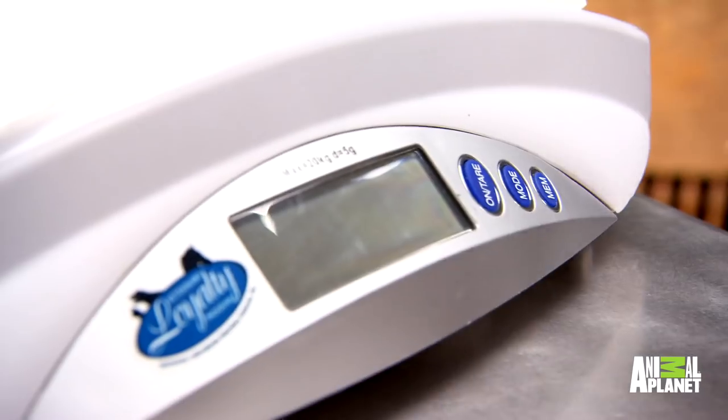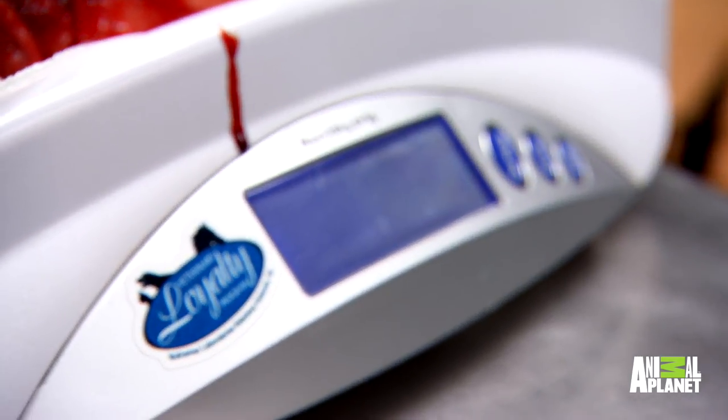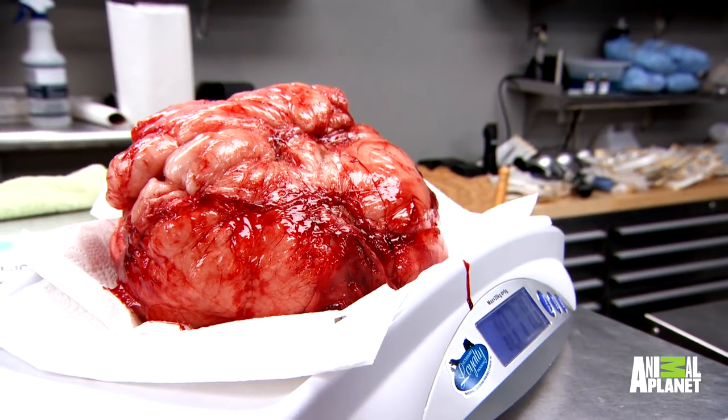How much do you think it's going to weigh? I'm saying seven. I'm thinking eight. 7.4. This is 10 pounds. All right, let's go. And the 10-pound fat tumor is big.